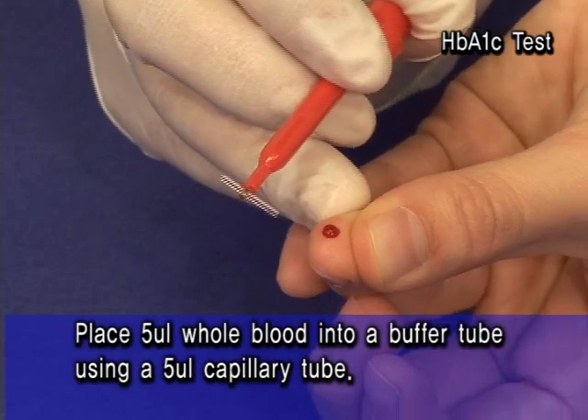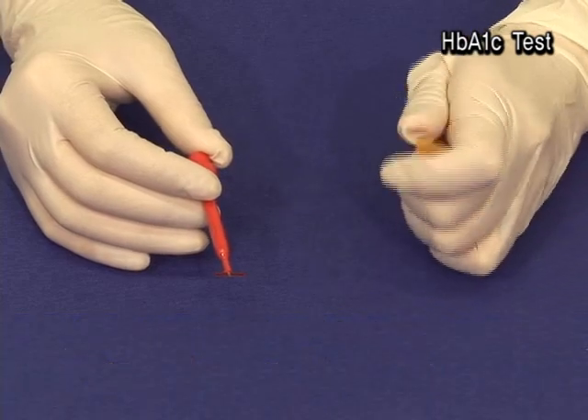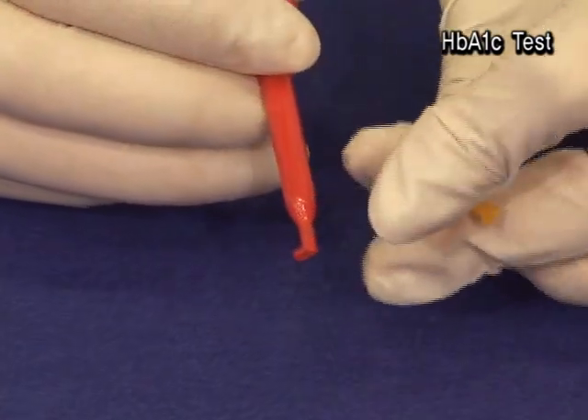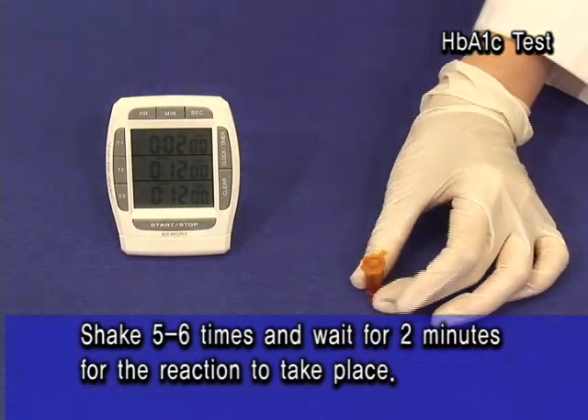Place 5 UL of whole blood into a buffer tube using a 5 UL capillary tube. Shake 5-6 times and wait for 2 minutes for the reaction to take place.